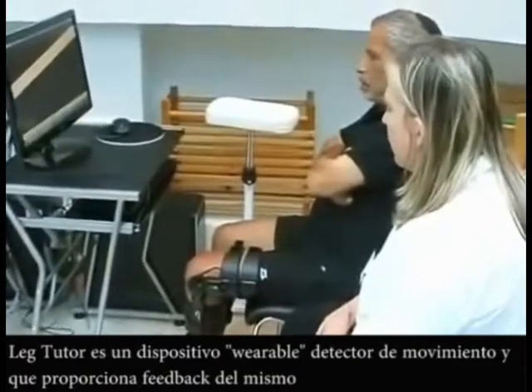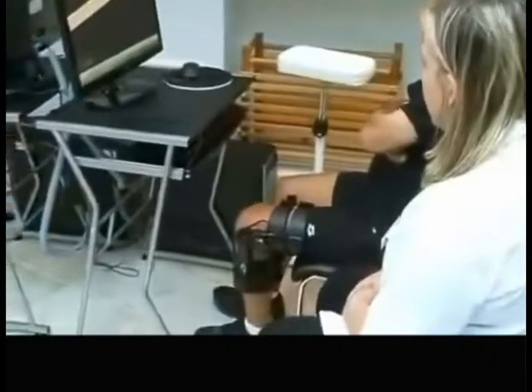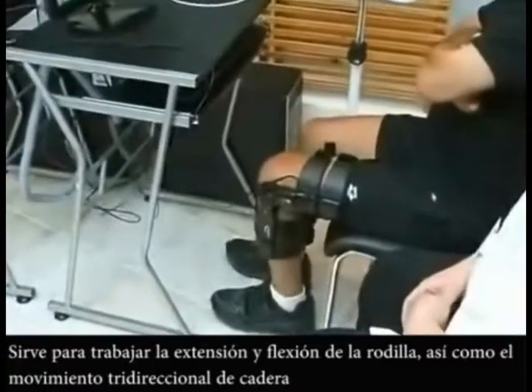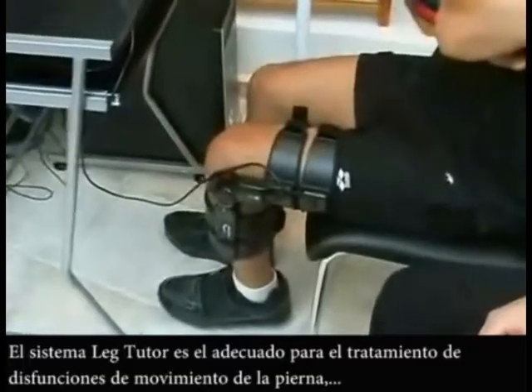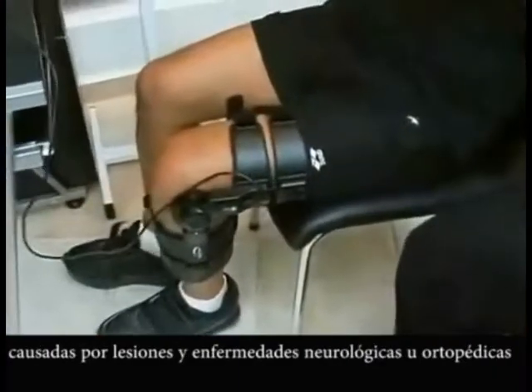The Leg Tutor is a wearable movement detection and motion feedback device that can sense knee extension and flexion as well as hip three-directional movement. The Leg Tutor is indicated for leg movement dysfunction following neurological or orthopaedic injury and disease.